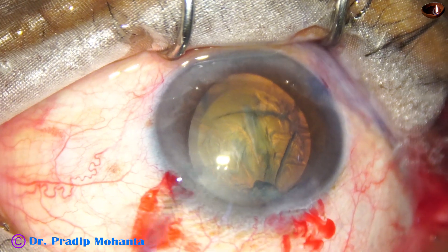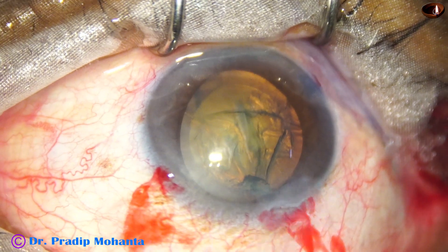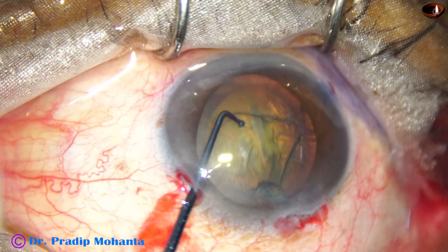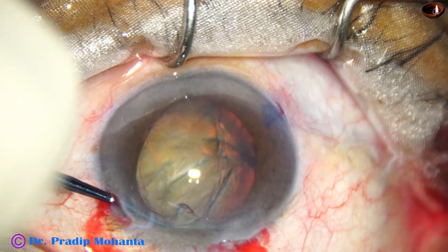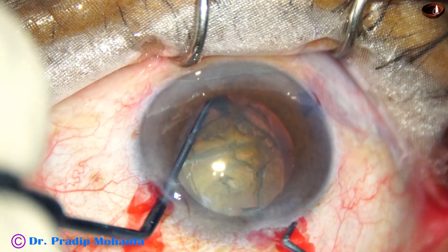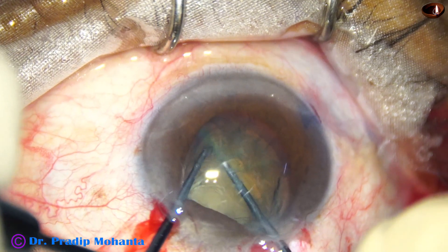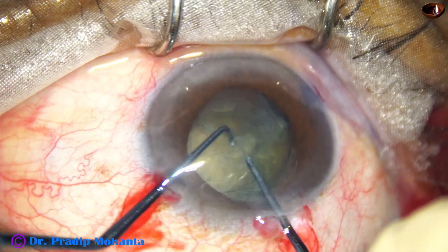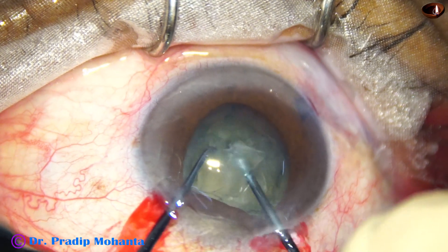Now my plan is to use the pre-chopper. I am using the long nucleus sustainer, the 1.9 millimeter one. I rotated the nucleus and now pre-chopping the nucleus into two hemi-nuclei — one hemi-nucleus is attempted to be divided.